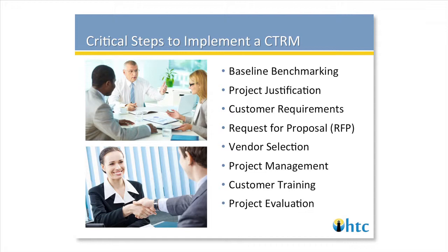And that usually involves both a patient quality justification and how you're helping the patient. There's also usually a cost savings portion, and that could be productivity for the site and other aspects of that. So usually it's a combination of the improvement of quality and the cost savings. So once you justify the project, then you'll want to understand what are the specific requirements that are needed for your institution. Some of the requirements will be similar between different institutions, but there will usually be aspects that are unique as well. So you want to understand those.